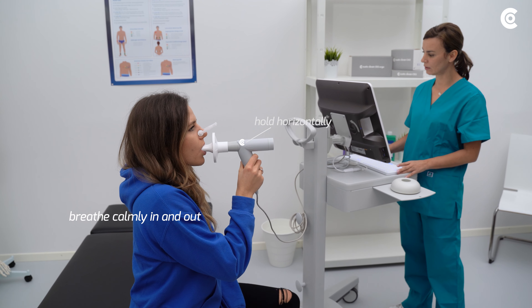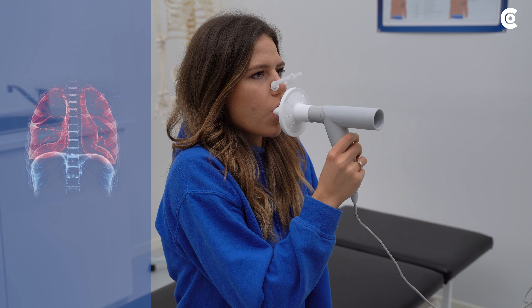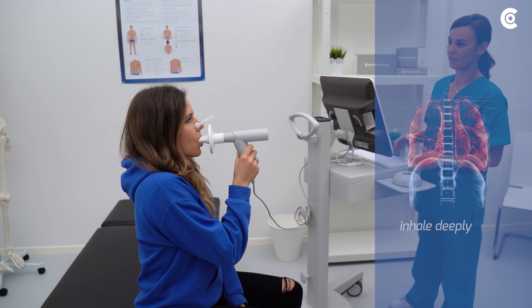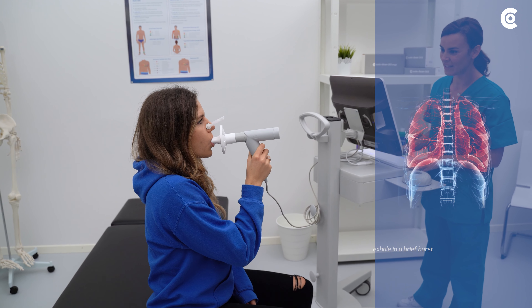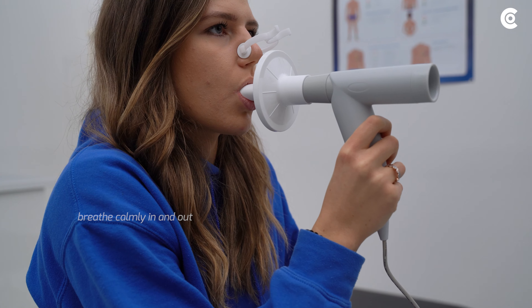Now, breathe in and out calmly for a moment. When you are instructed to perform the breathing maneuver, exhale deeply. Then inhale deeply as long as possible before exhaling in a brief burst. Continue breathing calmly and listen to the medical personnel's instructions.